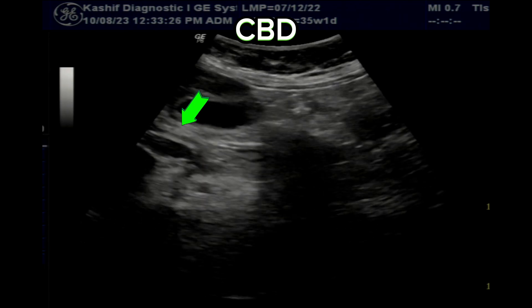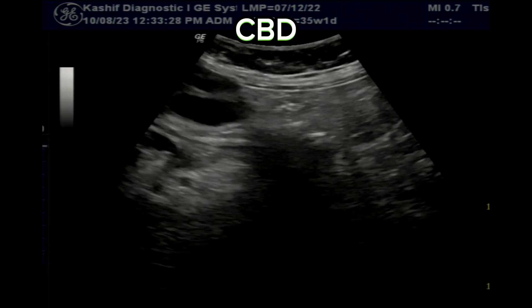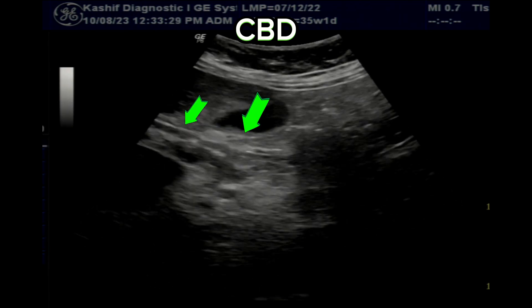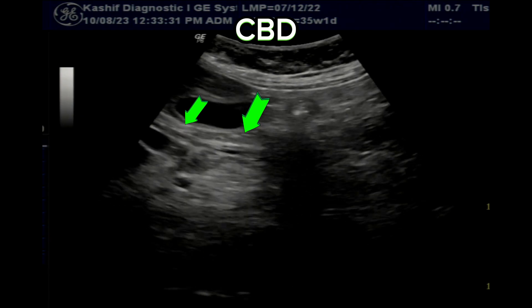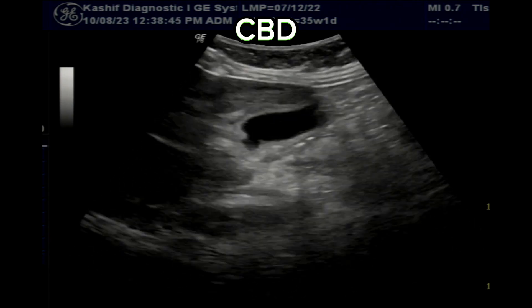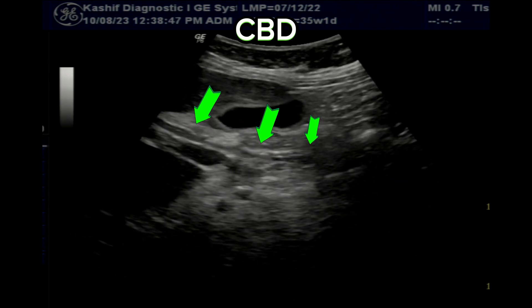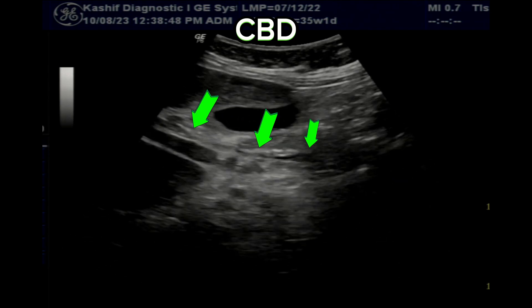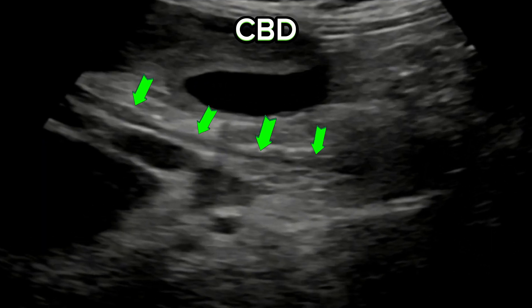The CBD is visualized in its full length and is normal in size at 3 millimeters. You can see the CBD up to its distal end. Proper CBD visualization in this case is the most important step for diagnosis.